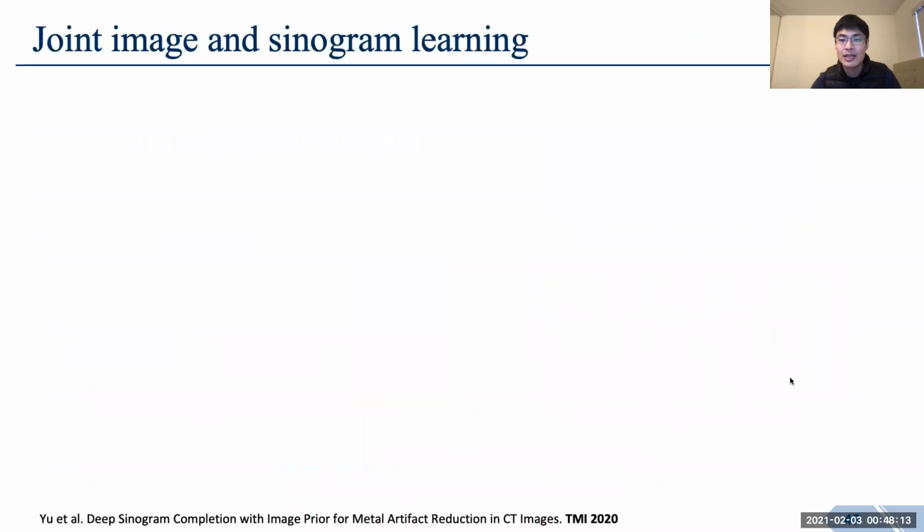And in this project, we want to develop a generalizable framework for metal artifact reduction by incorporating the domain knowledge, specifically the FBP or BP models, into the deep learning framework. And we formulate this framework as a prior image-based sinogram completion.